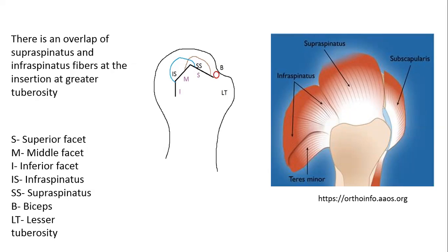As you go posterior, you can actually scan the entire posterior cuff in one sweep, going from the supraspinatus anterior portion to posterior, and then the anterior portion of infraspinatus to posterior. From there on, you will see teres minor attaching on the GT. That's the last attachment of a tendon on the greater tubercle. So you can check teres minor also as you are scanning infraspinatus in long or short. If you keep moving inferior or distal on the posterior aspect of the greater tubercle, that's the area where you will find teres minor.